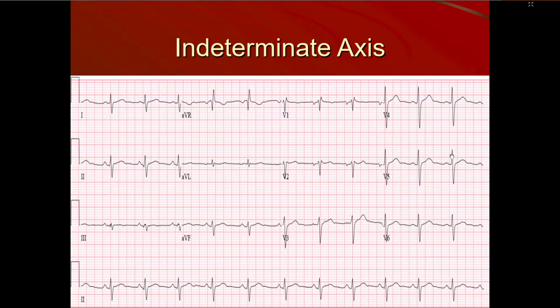Maybe there is a left ventricular hypertrophy also, and the electrical axis is changing, so you are not seeing a very deep S in V1, V2. So how will you confirm this? You can do an echo. Echo will show you the myocardial ventricular thickness, and it is the diagnostic test.